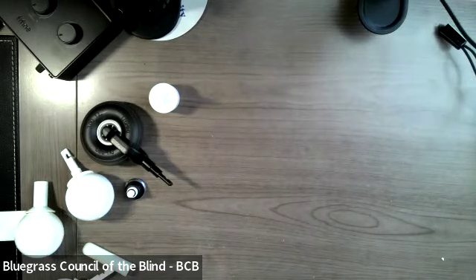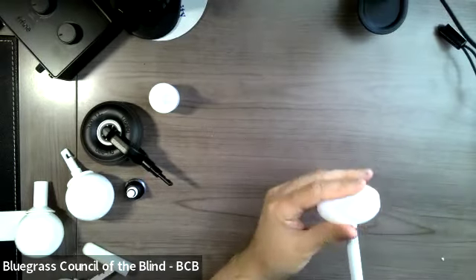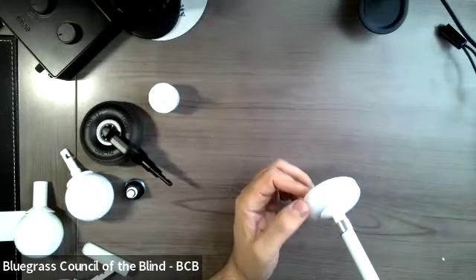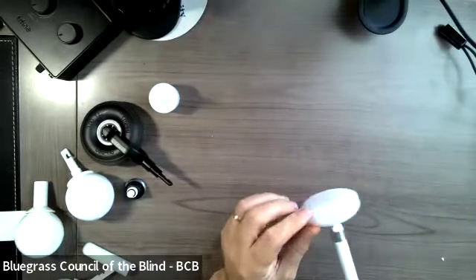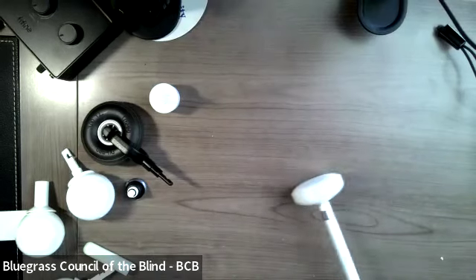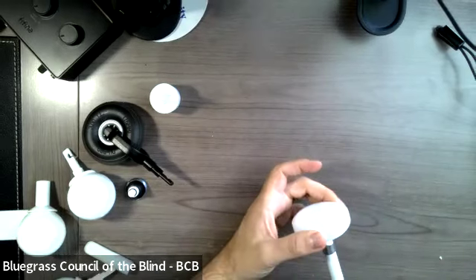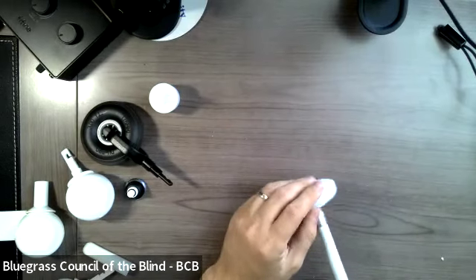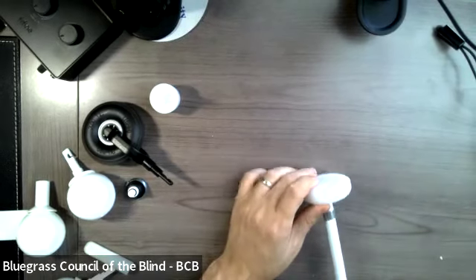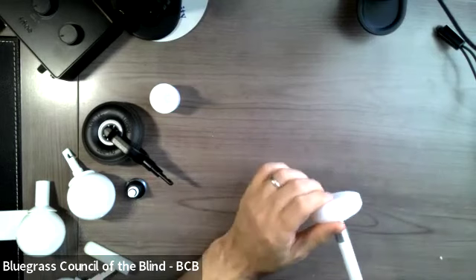Another great tip is the jumbo roller tip. This also kind of looks like a little flying saucer on the end of your cane. Very hard material. This is the high mileage jumbo roller, and it's called that because it just rolls back and forth beautifully. It's a disc on the end of your cane that's probably about 3 or 4 inches wide, and about an inch thick, and it just rolls back and forth. If you are a constant contact user and you're sweeping your cane back and forth, this is a fantastic tip.